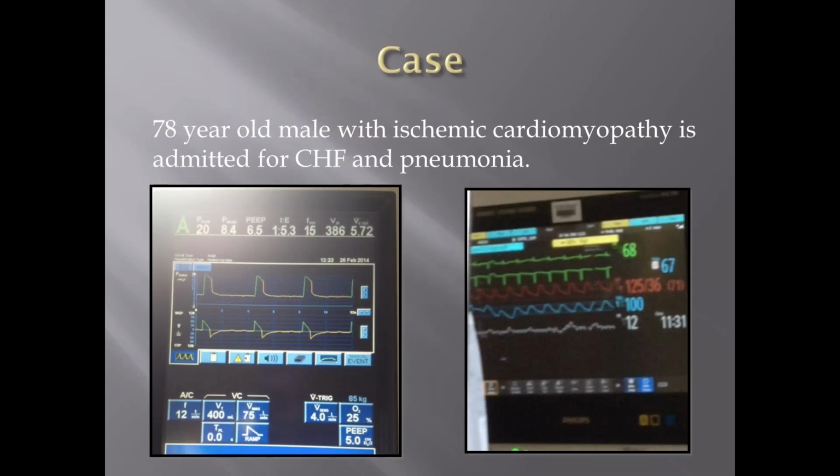So I had a similar case like this. I was a fellow actually, and the ventilator was set at 12 breaths a minute, and I saw the patient was actually over-breathing the ventilator, but they actually weren't. When I went over to the patient and put my hand on them, they weren't making any breathing efforts.